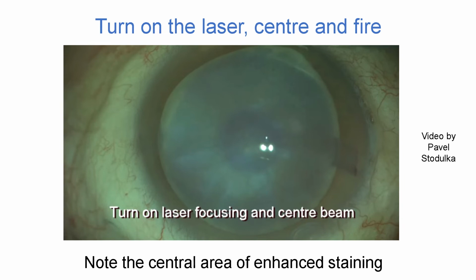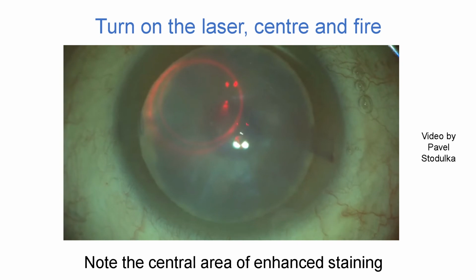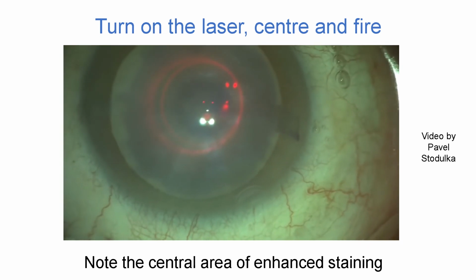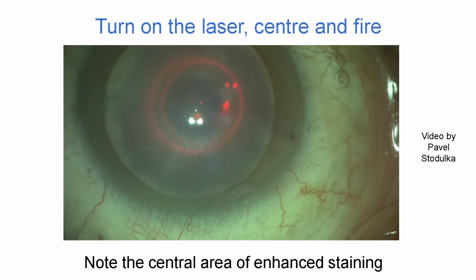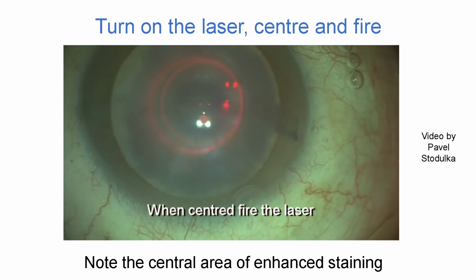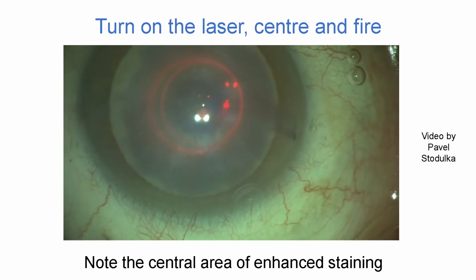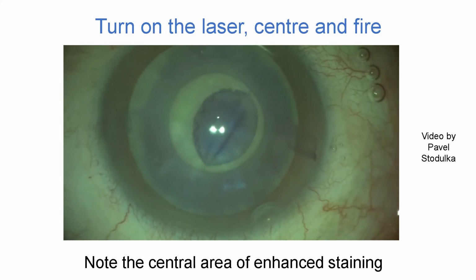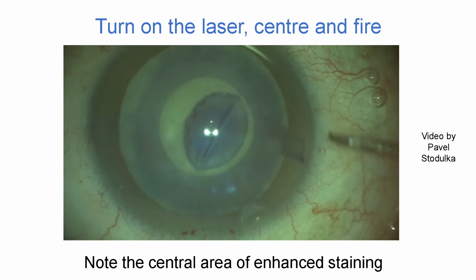We're now going to move on to the second stage, which is the focusing of the laser and centration. So now we can turn on the laser and the aiming beam, center it, and then fire the laser to create the capsulotomy. So the aiming beam is where the three little dots are. That's what's used for focusing. Then the circular beam is going to be centered on the area of enhanced staining. And once that's in position, you can see the capsulotomy is created in less than 0.3 of a second with no effect on this intumescent cataract whatsoever.